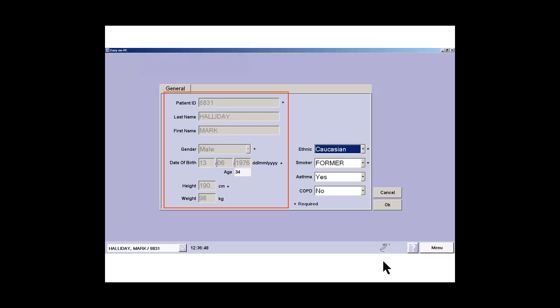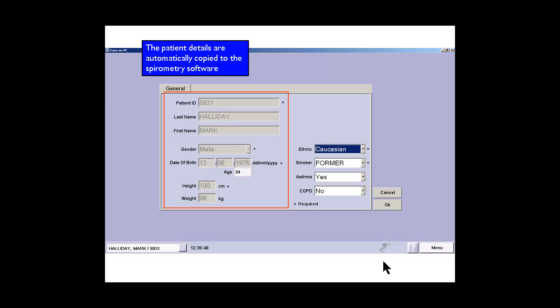The window now opens up on the Easy on PC software. You'll see that all the details again are replicated within the appropriate fields.